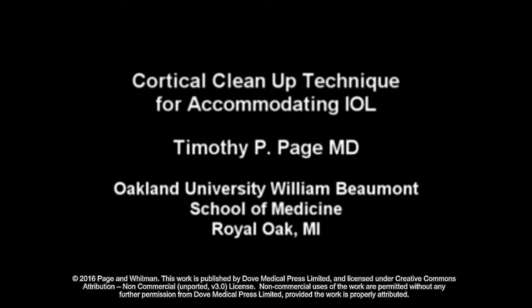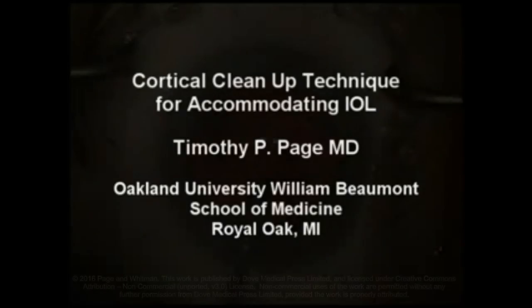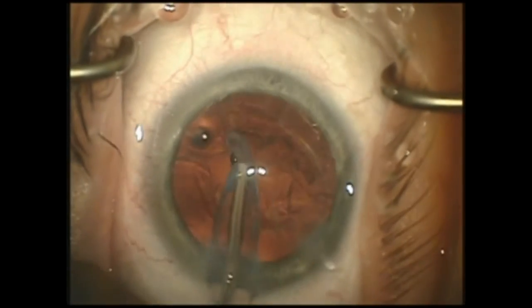This is Dr. Timothy Page from Oakland University, William Beaumont School of Medicine, and I will be showing my technique for cortical cleanup in the case of an accommodating IOL.